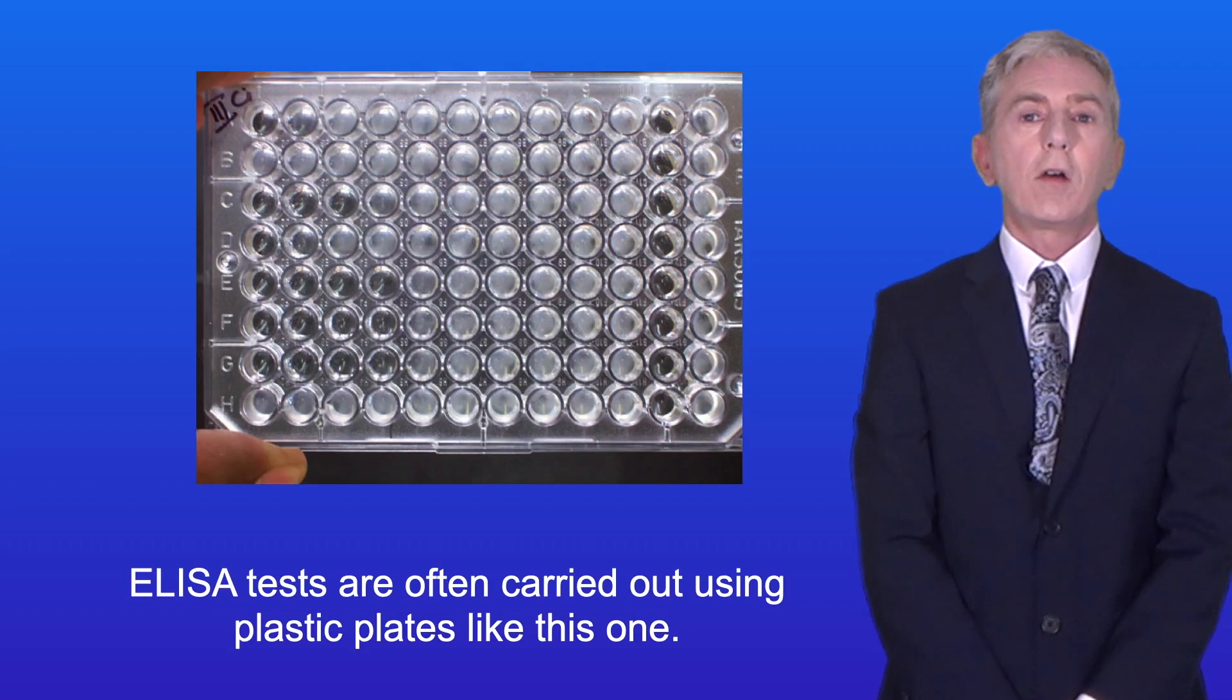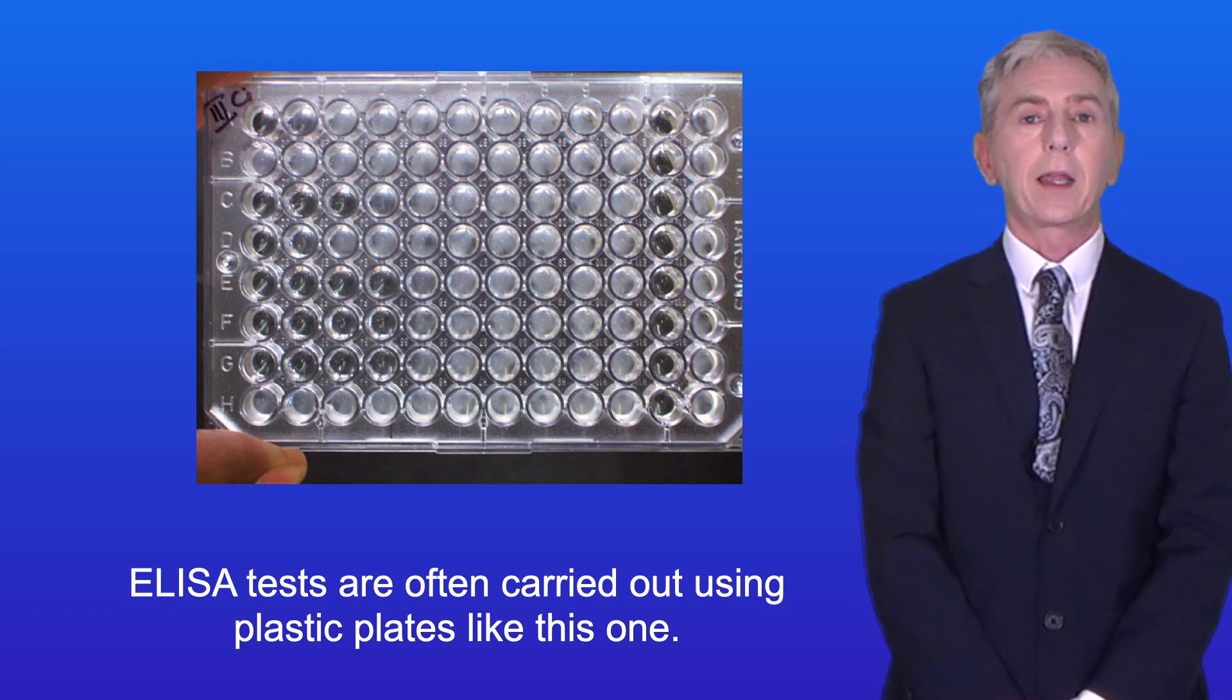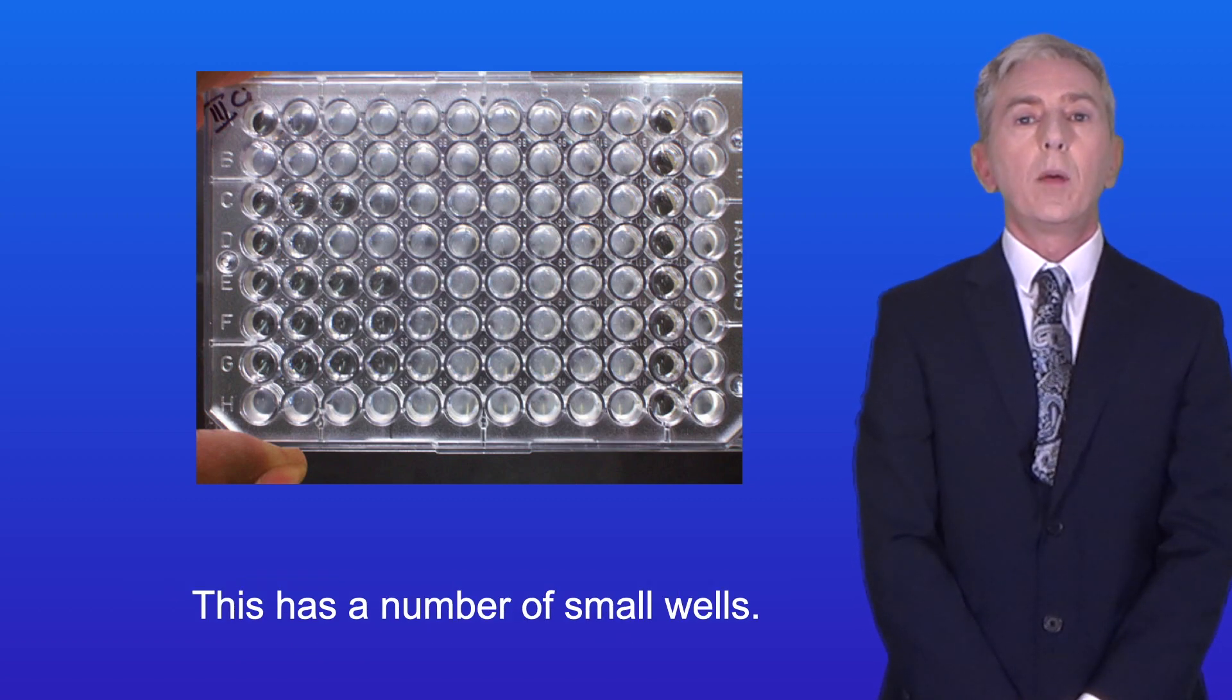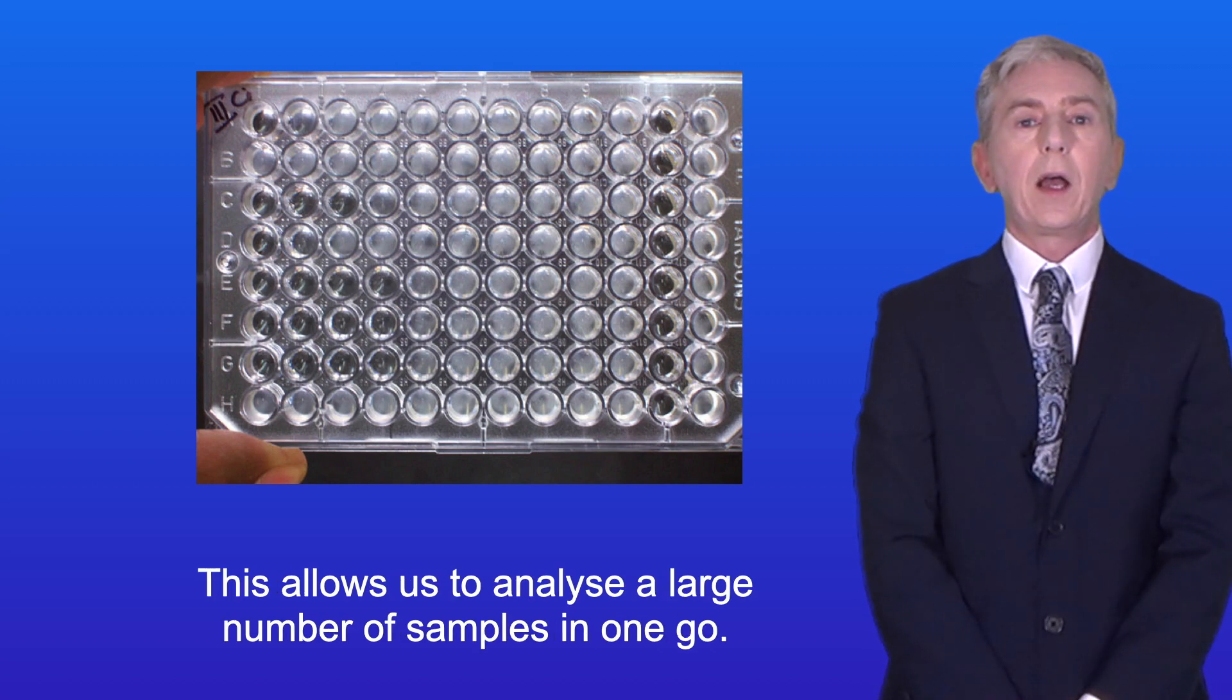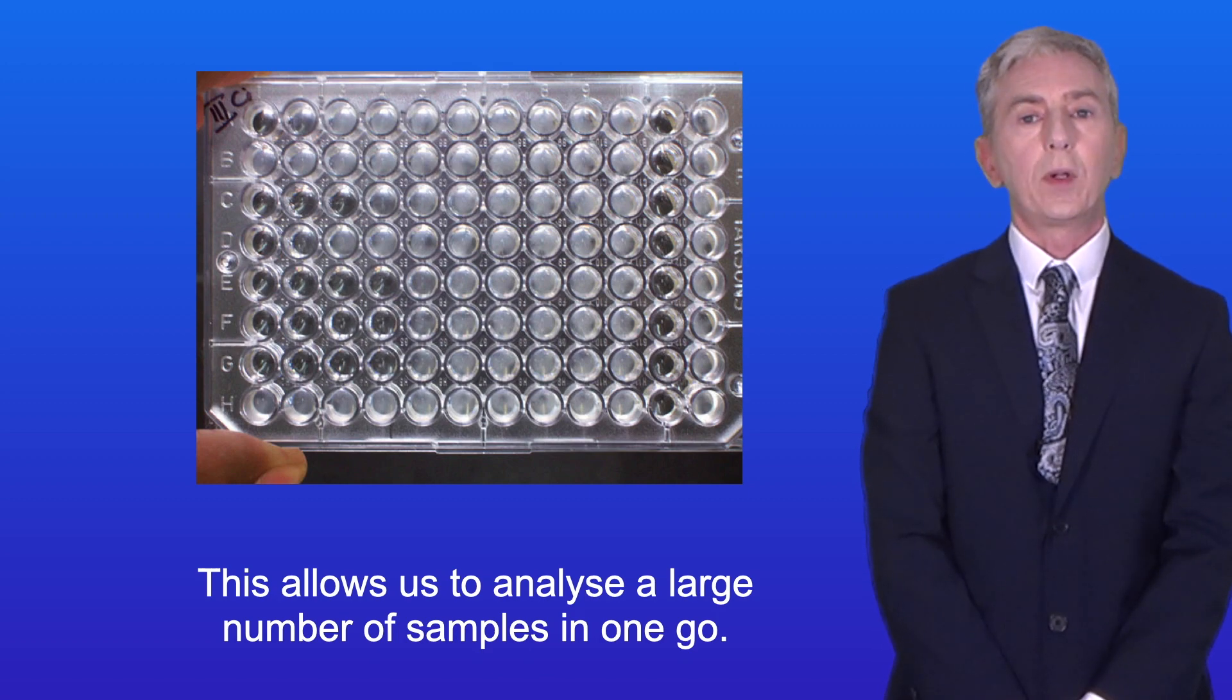ELISA tests are often carried out using plastic plates like this one. This has a number of small wells, and each well will be used to analyze one sample. So this allows us to analyze a large number of samples in one go.